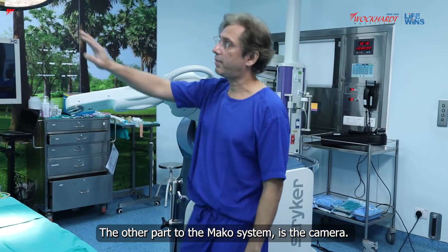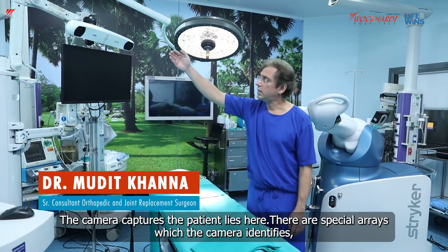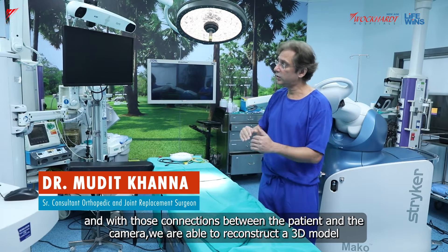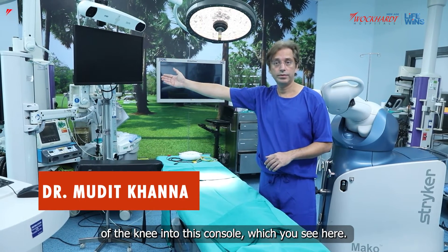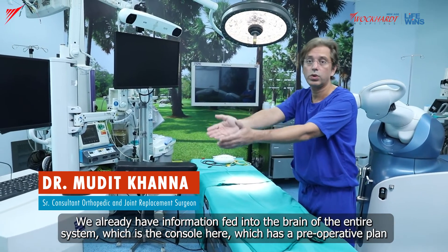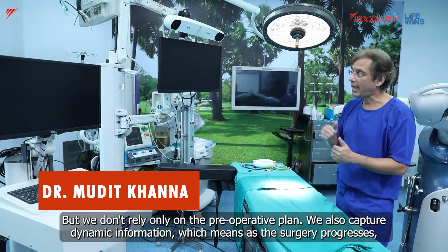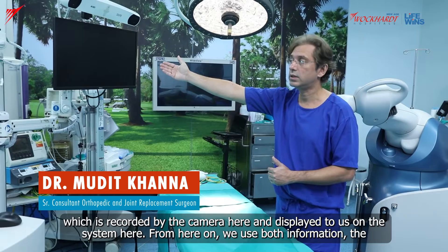The other part of the Mako system is the camera. The camera unit, as you can see, also has a screen attached to it. The camera captures the patient as they lie here. There are special arrays which the camera identifies, and with that connection between the patient and the camera, we are able to reconstruct a 3D model of the knee into this console which you see here.